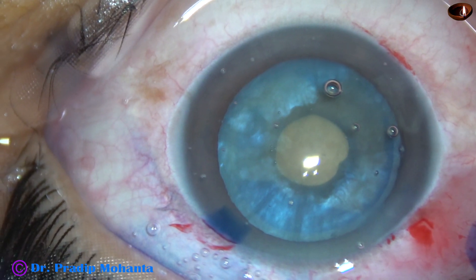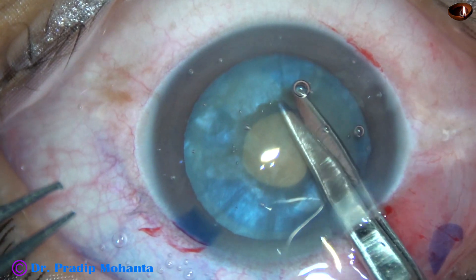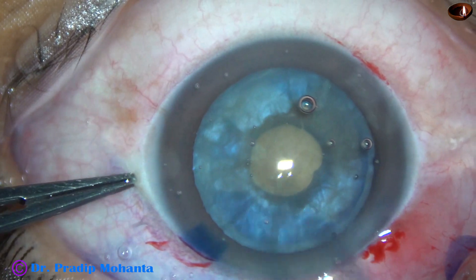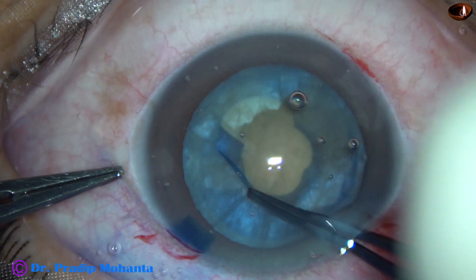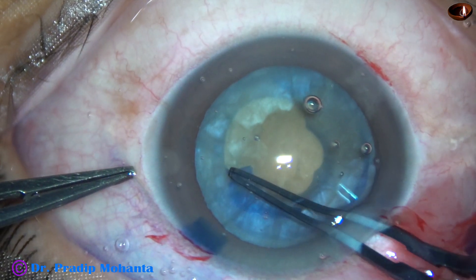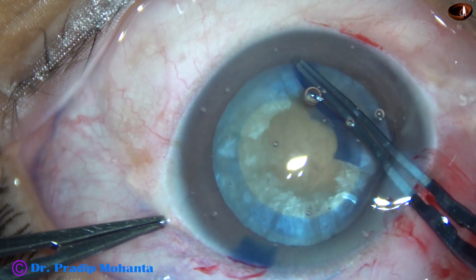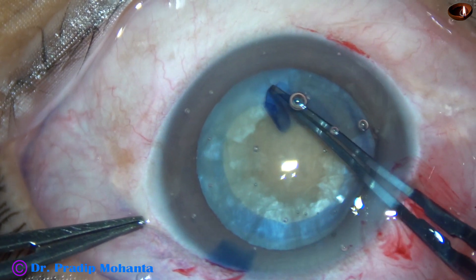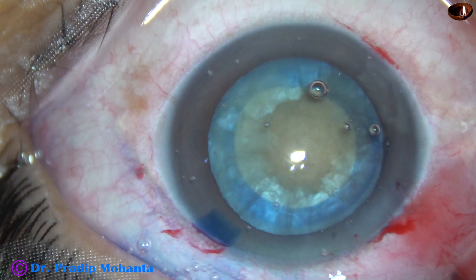This small mini rhexis is now enlarged to an optimum-size rhexis. A small cut is made at the margin of the mini rhexis, and with the help of a Utrata forceps, the rhexis is enlarged to an optimum-sized rhexis.